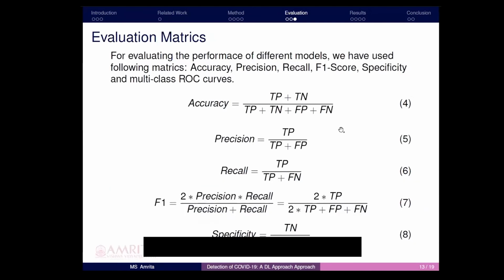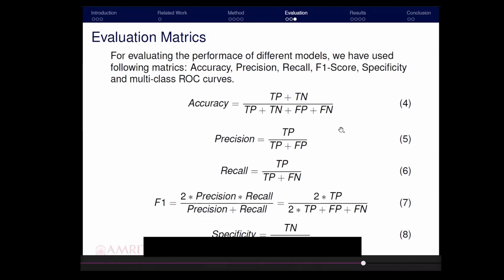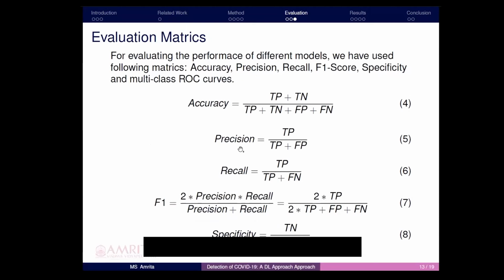Evaluation metrics. For evaluating the performance of different models, we have used the following metrics: accuracy, precision, recall, F1 score, specificity, and multi-class ROC curves.